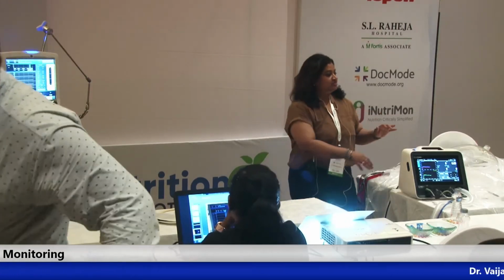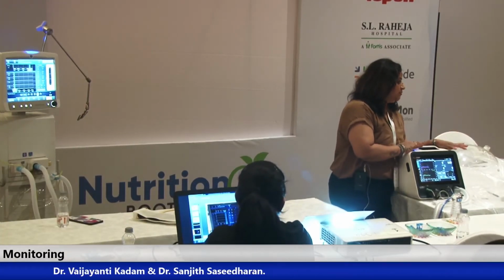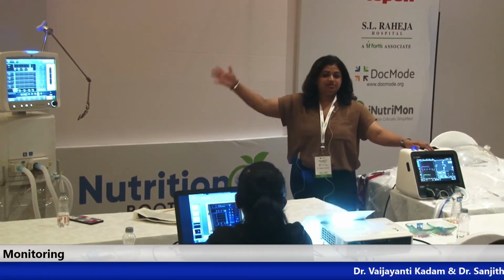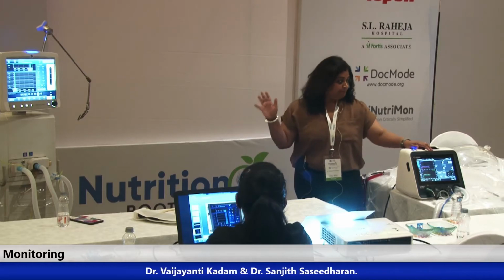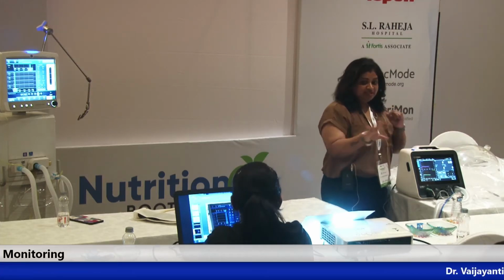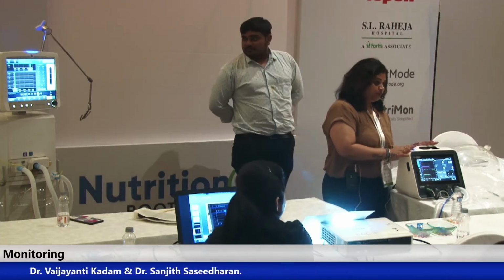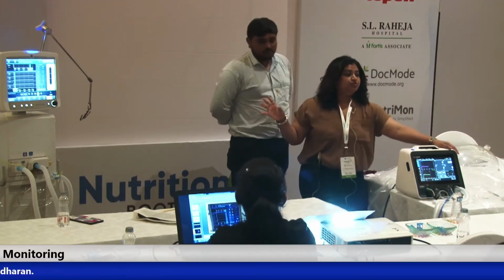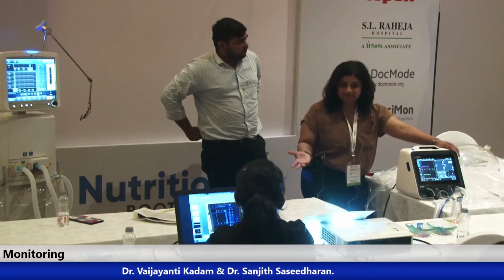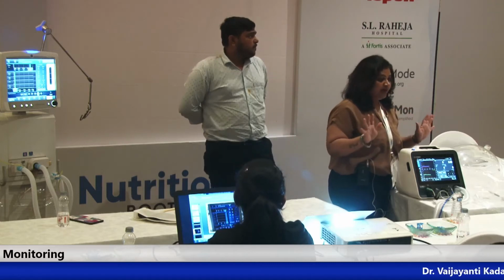So this is again an indirect calorimetry. It can be called a metabolic cart because it can be moved very easily towards our patient, as against the ventilator machine, where we need a patient on a ventilator to check. But with this, we can measure a patient who is spontaneously breathing, who is on NIV support, and who is on a ventilator also. For the earlier machine, we have to calibrate it and it takes 30 minutes of warm up time to start giving readings. But with this, the best thing is that it has no warm up time at all.